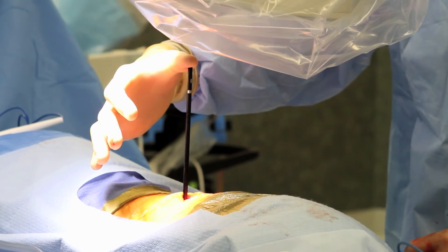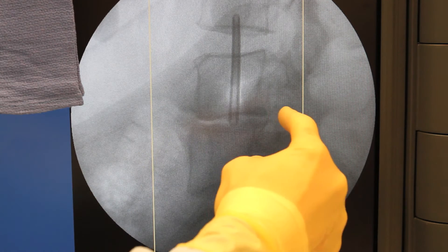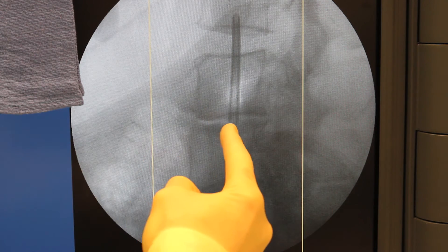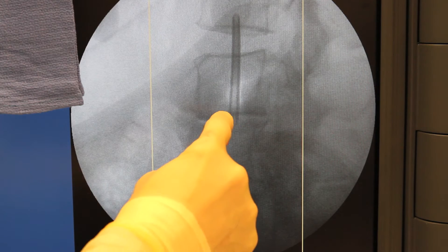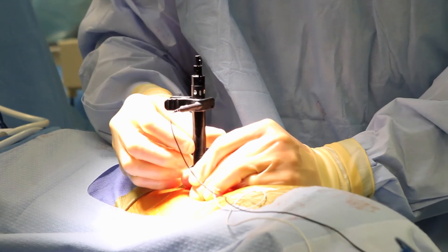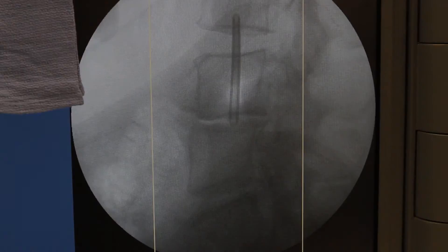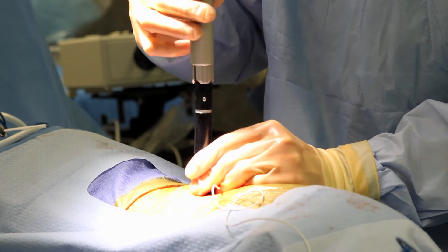You can see the degenerative disc, the anterior osteophytes, the posterior osteophytes, and the collapse. Now we're going to create a working channel over this dilator safely using monitoring to go through the psoas muscle and prevent any damage to any nerves, and then work on the disc space.